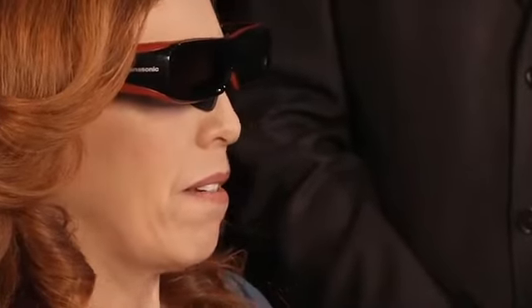I feel like my eyes are adjusting all the time to try to see it clearly. And they are. Yeah. But once I focus on it, it's very clear to me that it's coming out towards me. And sometimes it blends right in with the box, and sometimes it's sitting way out in front towards me.